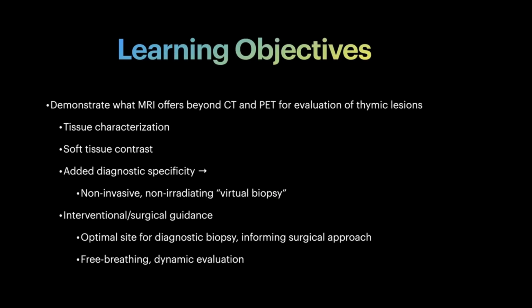I'm going to demonstrate what MR offers beyond CT and PET for evaluation of thymic lesions in terms of tissue characterization, soft tissue contrast, and thereby added diagnostic specificity. In essence, MR offers a non-invasive, non-irradiating virtual biopsy in many cases. It can also assist with intervention or surgical guidance, offering the optimal site for diagnostic biopsy and informing surgical approach. It can also provide free breathing dynamic evaluation of various anatomic structures and show the relationship of a mass to the chest wall dynamically.